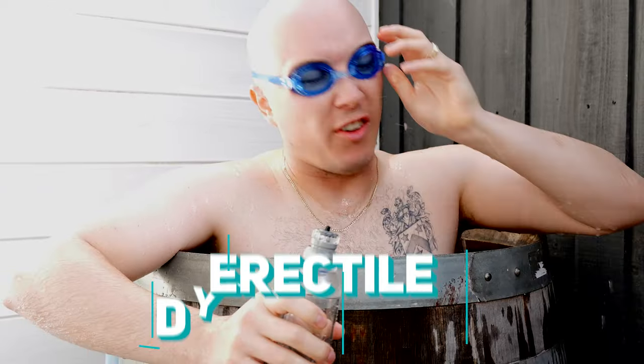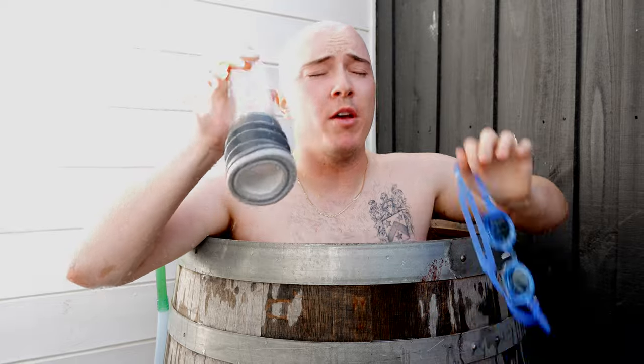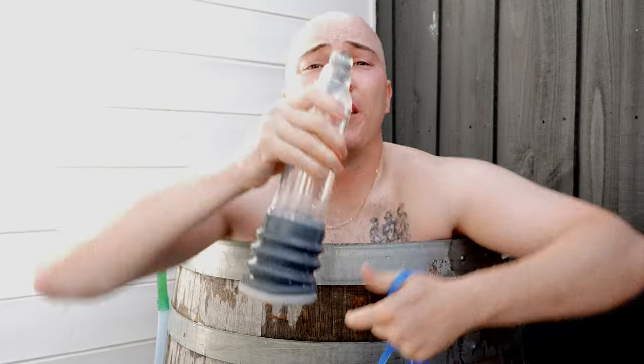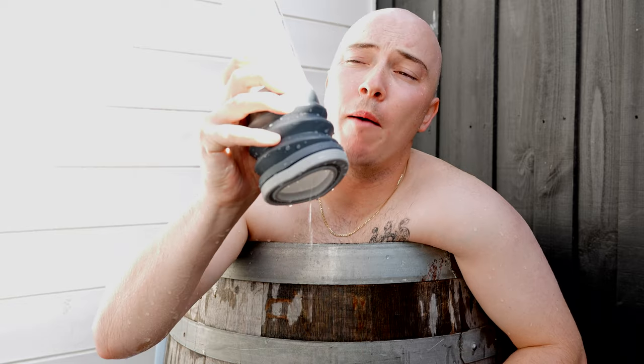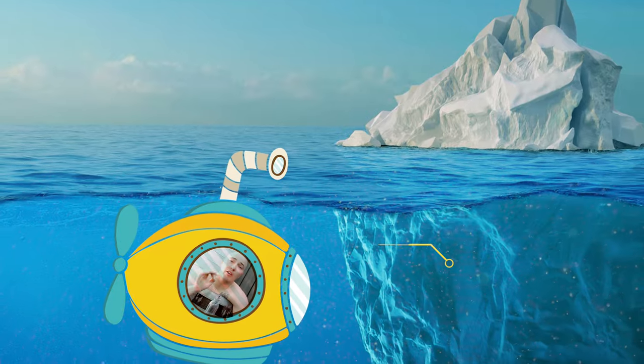Hey guys, welcome back to the channel. If you're experiencing erectile dysfunction and you have not considered trying a penis pump, you're wasting valuable time — because if you're watching this video, there's a good chance your erections need a little pump up, pun intended. Just sit back and relax because I am about to do a deep dive.